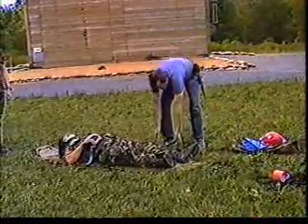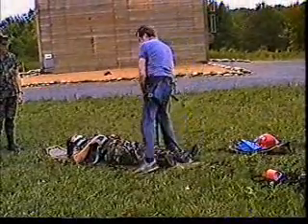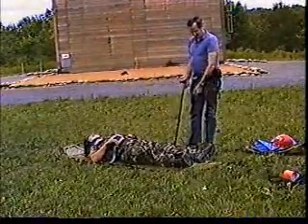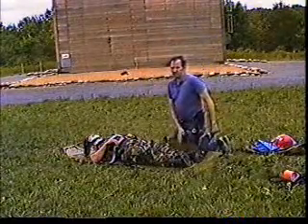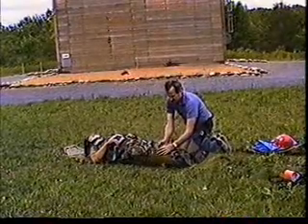If you have a patient with a head injury or other reasons that there might be a violent patient, you want to make sure you don't get kicked. You're not going to straddle this guy and start fastening straps. What I do is I'll lift the strap up while I'm still standing and I can see what's going on. I'll kneel down next to this. Now I've got a deflector here and I can watch what's going on. Reach across and fasten straps.